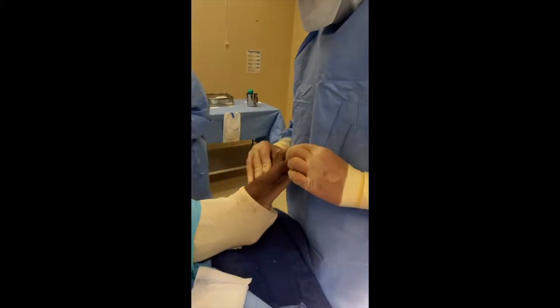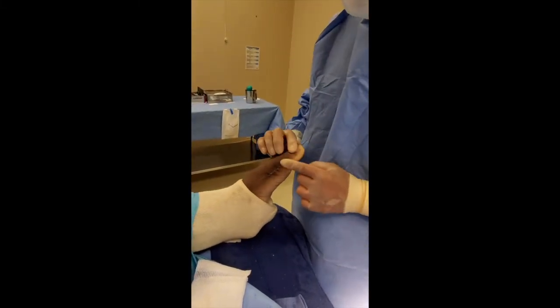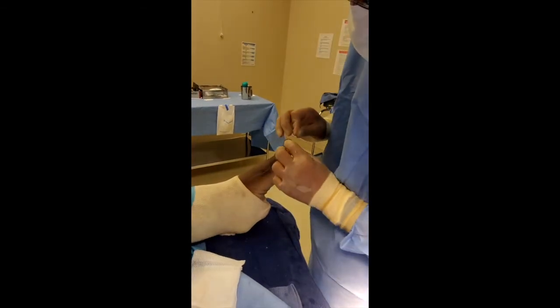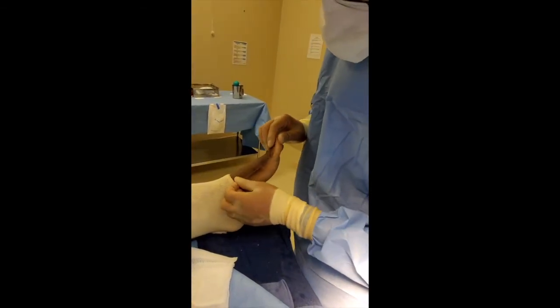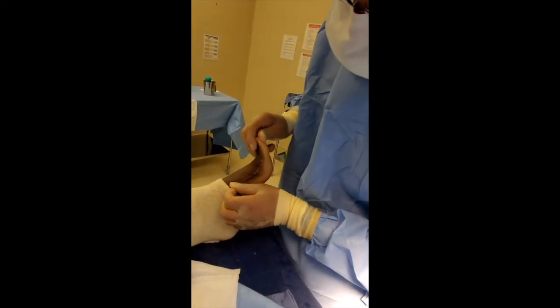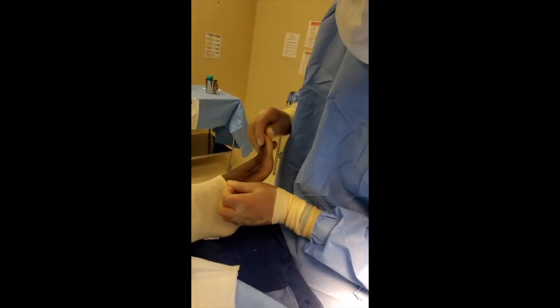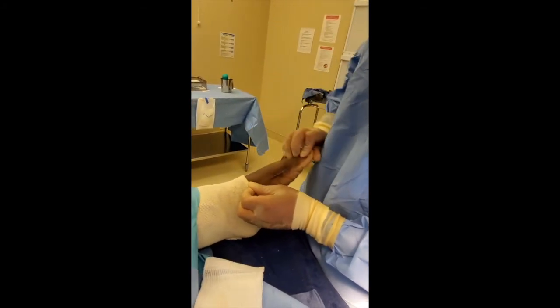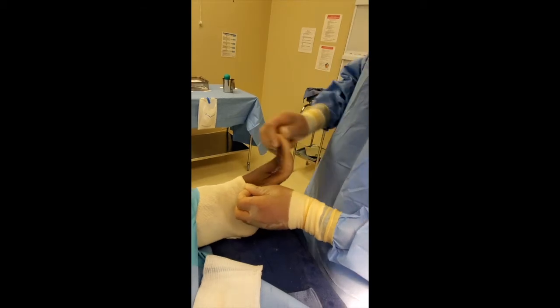We're just going to bandage up his foot. You can see the bump is now gone — it's not bulky here or on the side. Just got done sewing up his skin. Again, you can see we've bent it up and down — look at that motion, nice and smooth inside. There's no gritting, grinding, or crepitation. There it is. One happy camper.